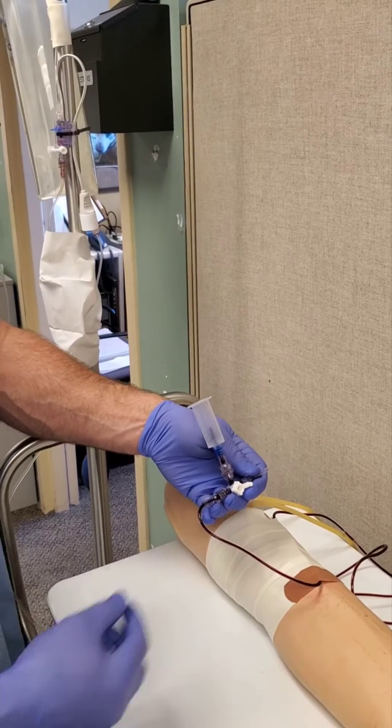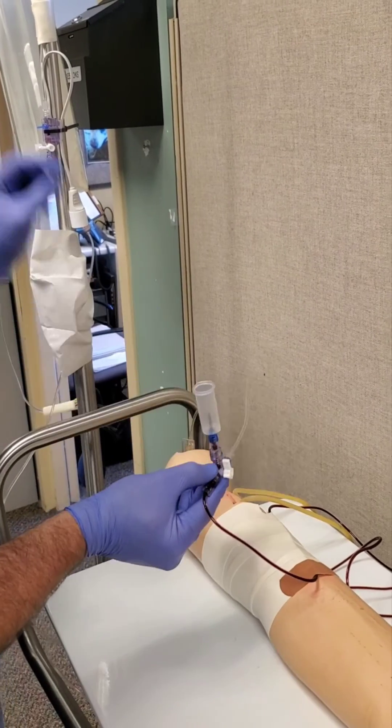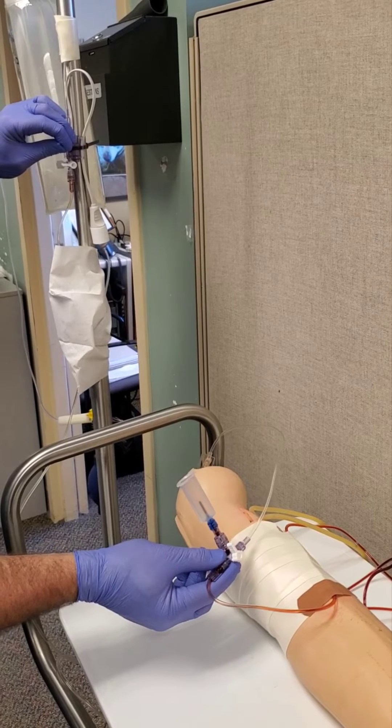Now that we have our sample, we'll clean out our lines. Put the stopcock up and flush out the line first using the pigtail, pulling it until the line is clean of blood.